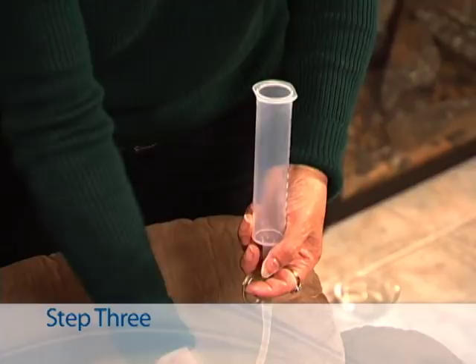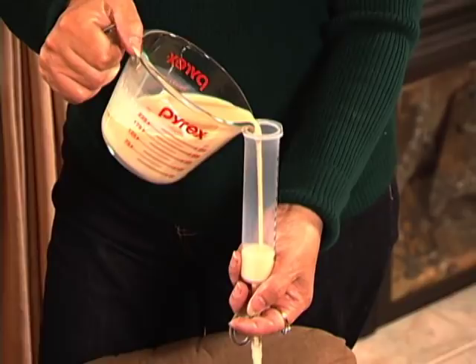Step 3. Filling the syringe. Pour the formula into the syringe. Add formula as needed to complete the feeding.